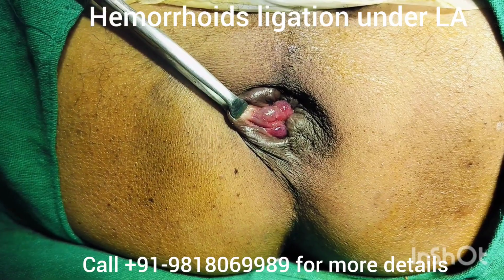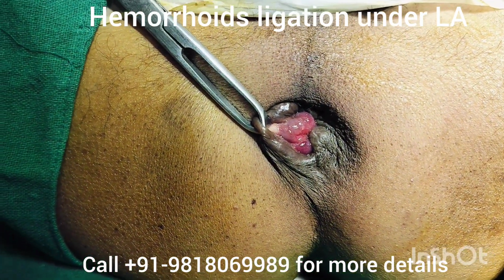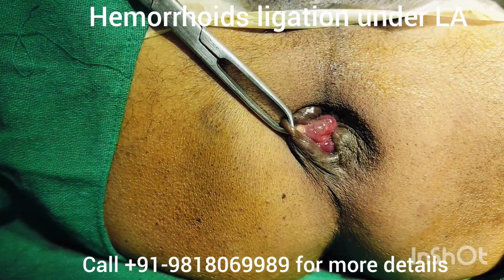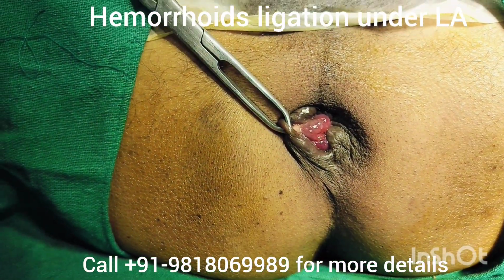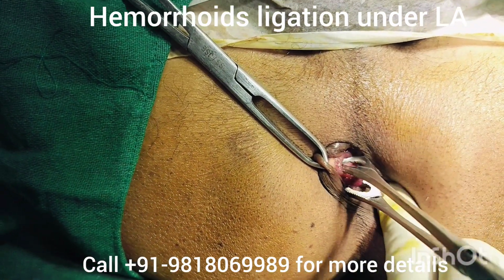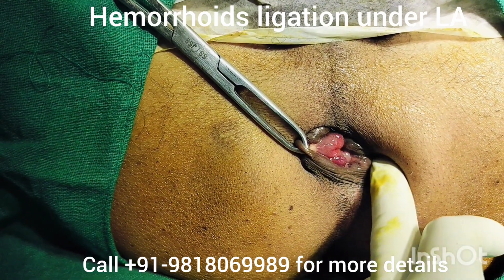Hello friends, today we are going to operate this case of hemorrhoids. This is a case of 3rd 4th grade hemorrhoids. Patient is male, 65 years age. We have already given pudendal block, local anesthesia in this case, and now we are ligating it.